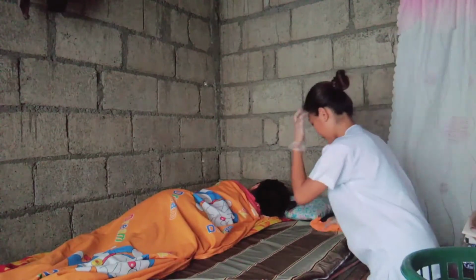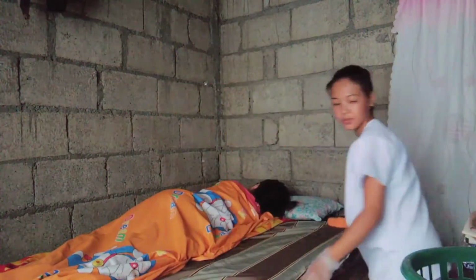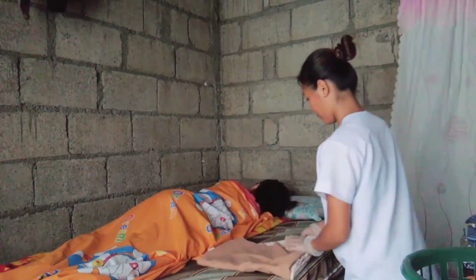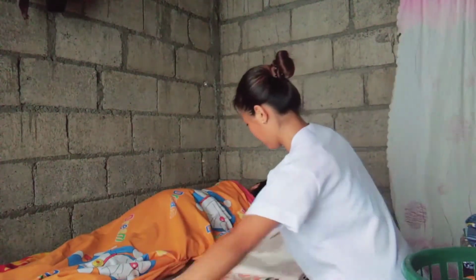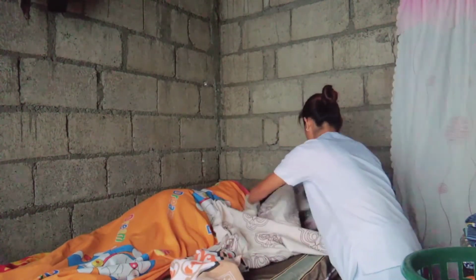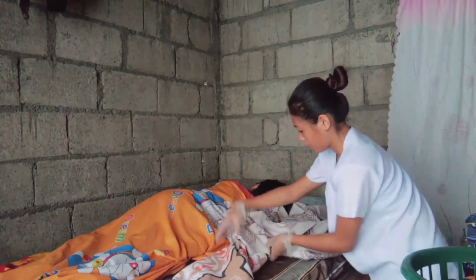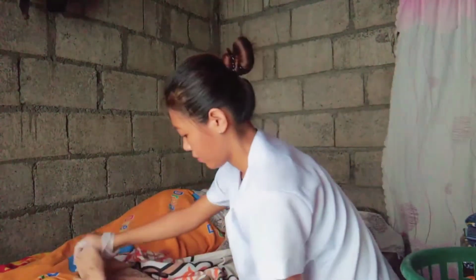Clean and dry the mattress if it is wet or soiled on this side. Next, place a clean mattress pad, folded lengthwise on the bed with the center in the middle. Pan-fold its top layer over the mattress.